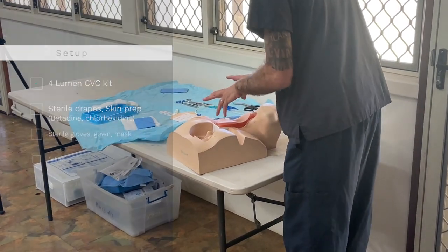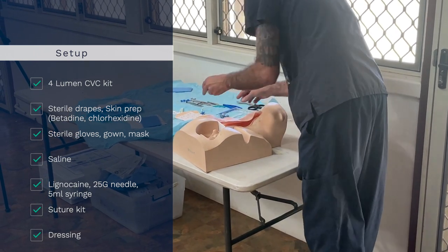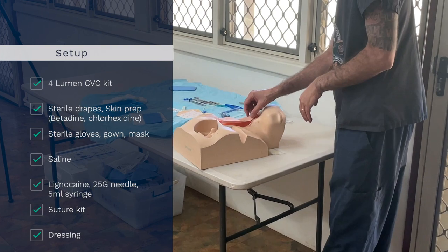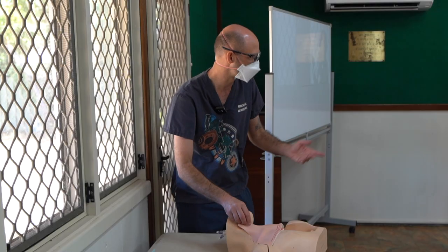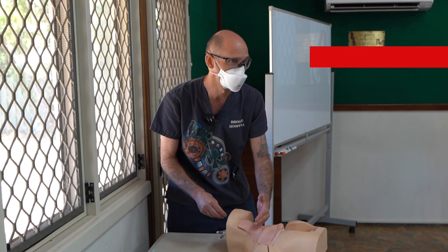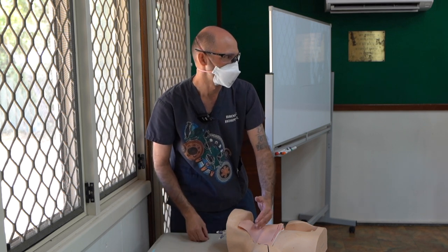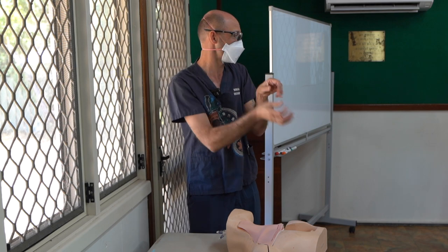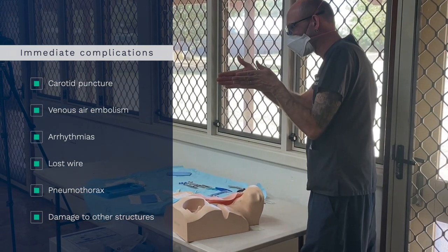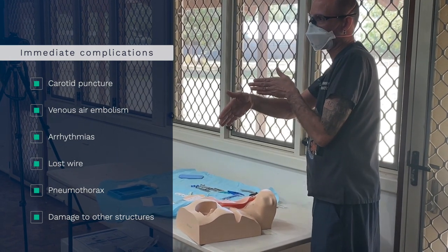Without talking about that anymore, I've preset myself up here. First thing — I've got an ultrasound. What vessel do we typically use for a CVC? Internal jugular. So I'm going up and down my internal jugular with the ultrasound. In relation to the carotid, is there a little trick I might use? If the carotid sits right behind the IJ, there's a risk you can puncture through your internal jugular and go into your carotid. So you try to find a position where the IJ sits a little bit to the side of the carotid, so you don't accidentally back-wall your IJ into the carotid.